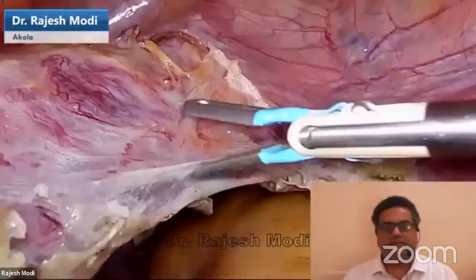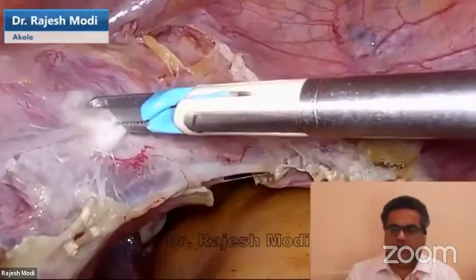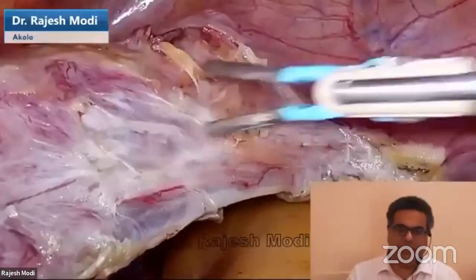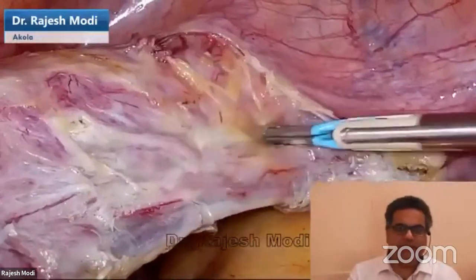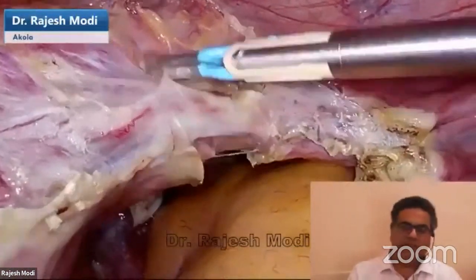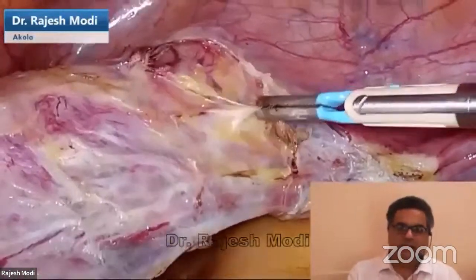Sorry. The same step is now being repeated on the other side for the same surgery. Once you have the dissection done, one step beyond, this is the bladder pillar which we are peeling off. Now on the right hand side, because I am using the contralateral part, one instrument comes inside. So I have to alternate with the bipolar and scissor. So I'm more tuned to a little more blunt dissection on the right hand side, but the concept remains the same, that we want to push the yellow part, the fat part of the bladder pillar a little lower down.